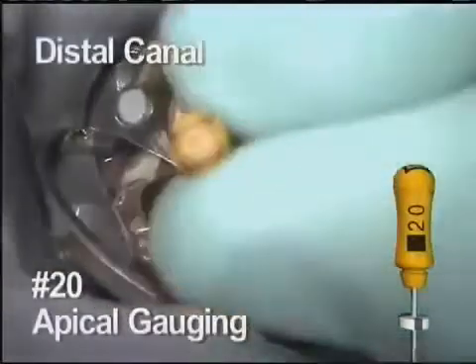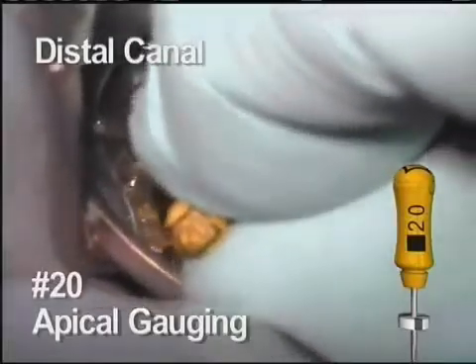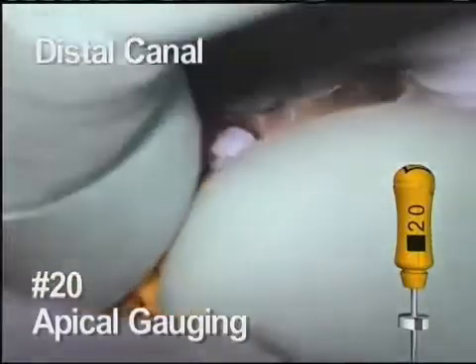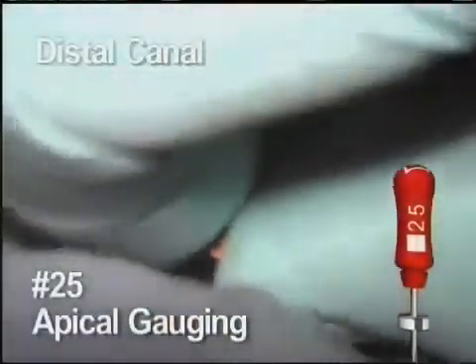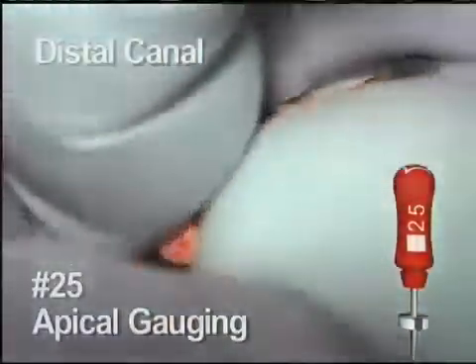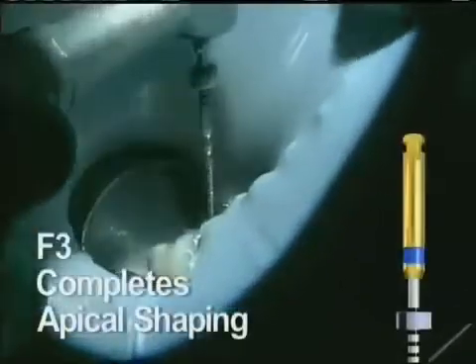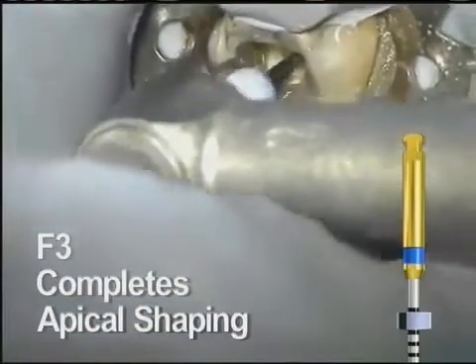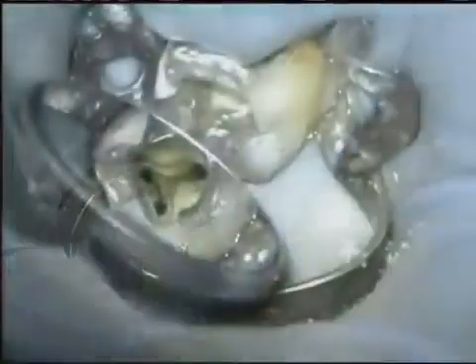To show canal variations, let's take a look at the gauging procedure of the distal canal of this same tooth. This canal followed the same instrumentation procedure as the others. The 20 is loose. The 25 is also loose at length. The 30 hand file will make it but it is tight. The clinical decision is to use finishing file number 3 for apical shape here. The F3 is taken to length and removed, and the canal shaping is complete.